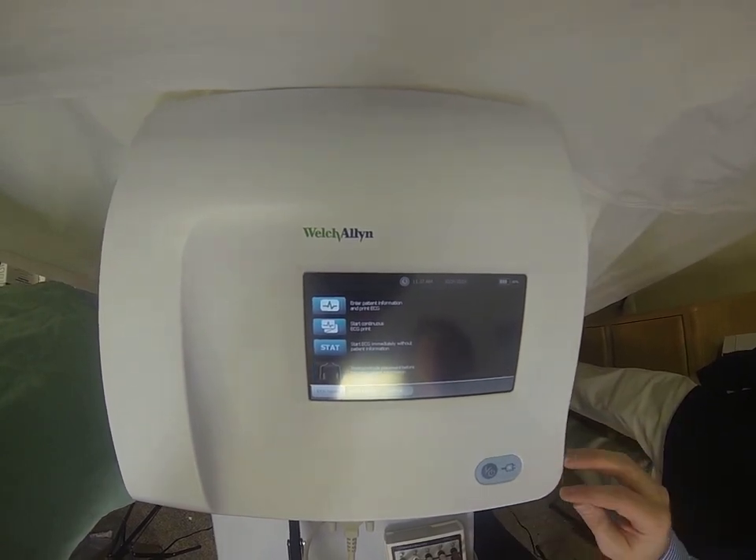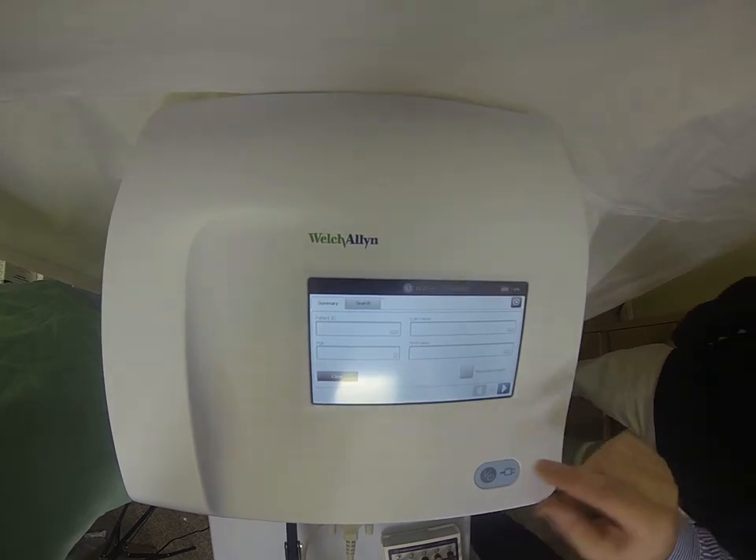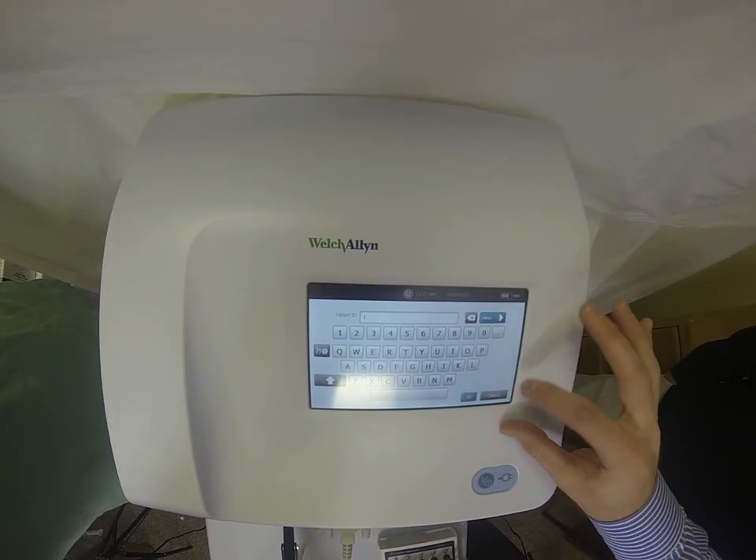We're just going to walk through a test today. In order to perform a test, just a few clicks of a button. Enter some basic patient demographic information.